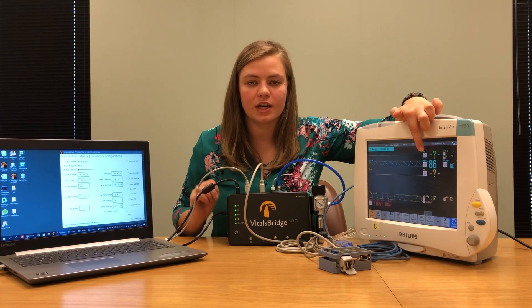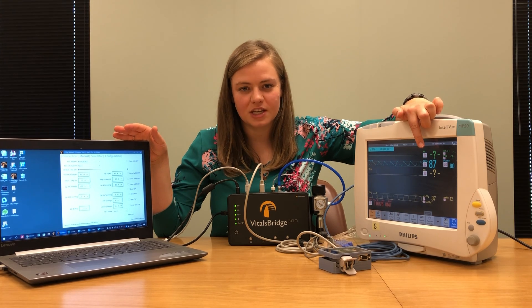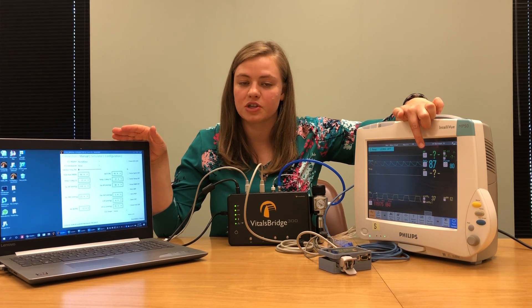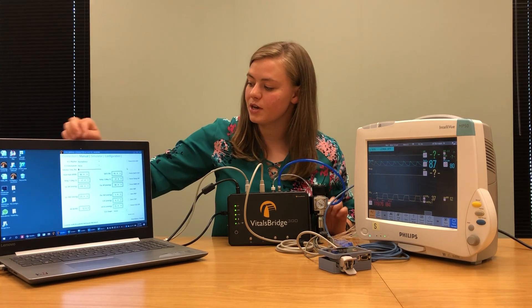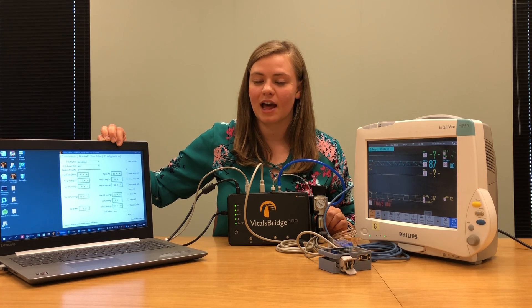Notice that the SpO2 reading on your computer screen and monitor may not match the ones coming from your connector software. This is okay — it just means you need to perform a quick calibration. The calibration of SpO2 is done the same way as the calibration for carbon dioxide: go to the configuration tab in your VitalsBridge software and perform the calibration as directed by the prompts on screen. Further information is available on VitalsBridge.com/downloads.